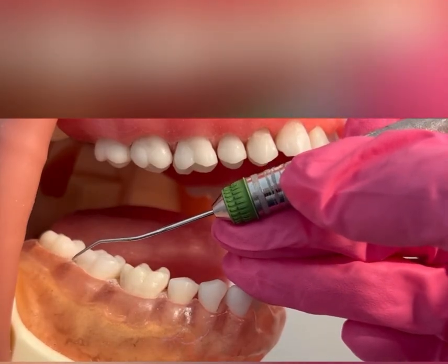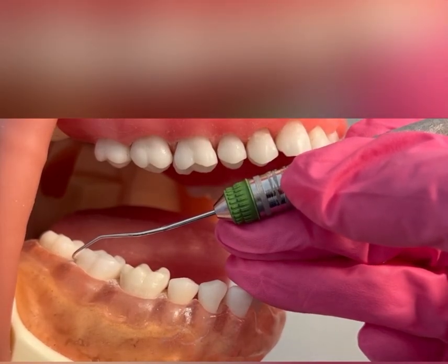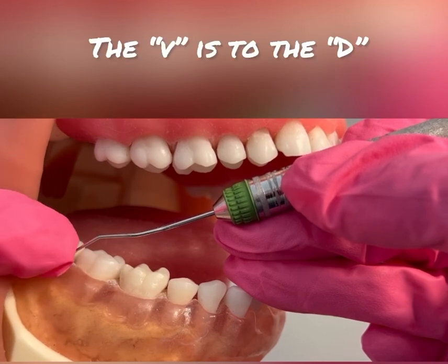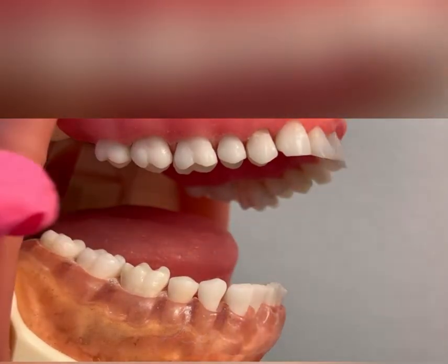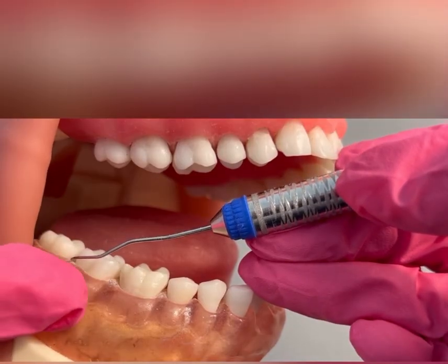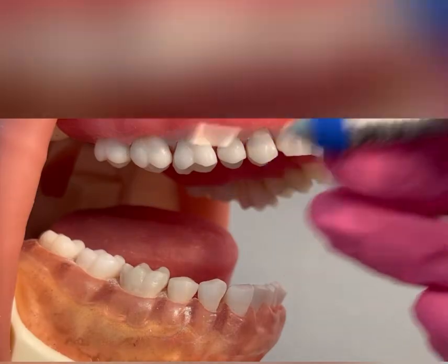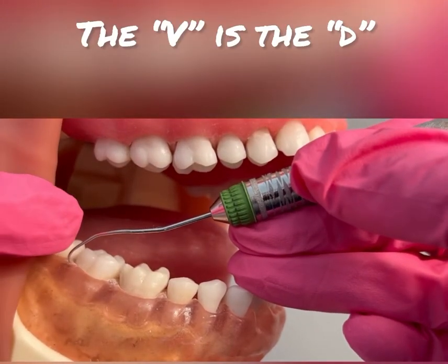First, I will show you how to find the correct working end. If I hold the Explorer to the distal of the tooth I'm going to explore, you can see that the terminal shank goes up and over the tooth. You can also see this bend — or elbow — is pointing towards the distal. If I flip it, the terminal shank goes across the tooth and the elbow is pointing towards the mesial. That is not correct. Flipping it back to the correct working end — we call it V to the D.